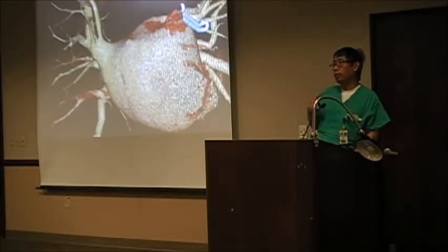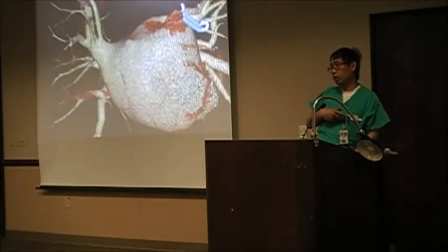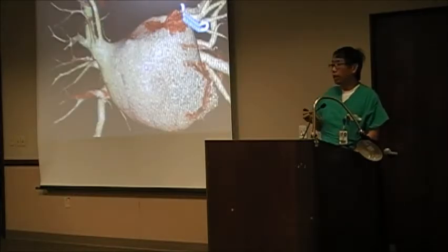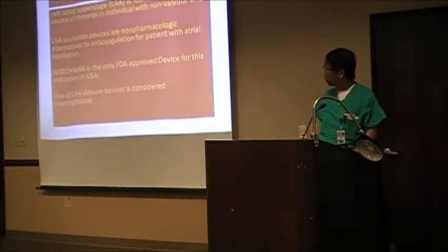I have followed him since the maze procedure for almost 16 months, and we have a chip in his chest to monitor him, which we call the Reveal monitor. Some people must have that. He has no atrial fibrillation at all. Now he is off the Coumadin and has gone back to work. This is probably my last slide.